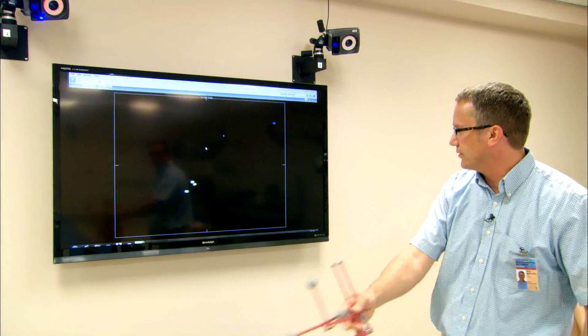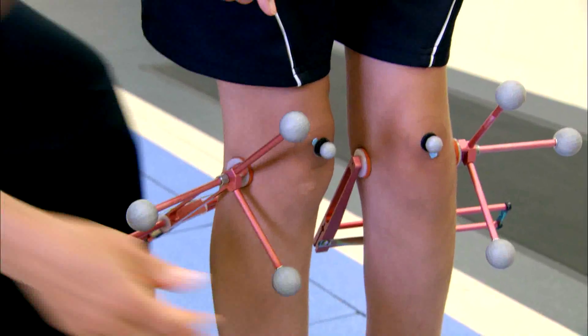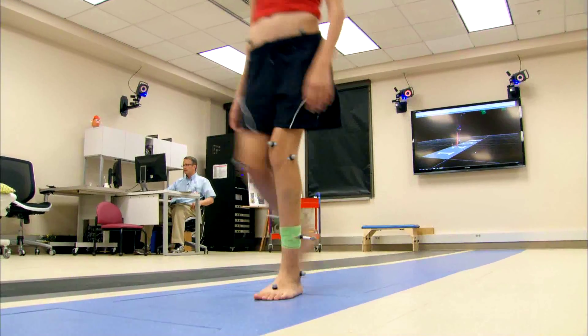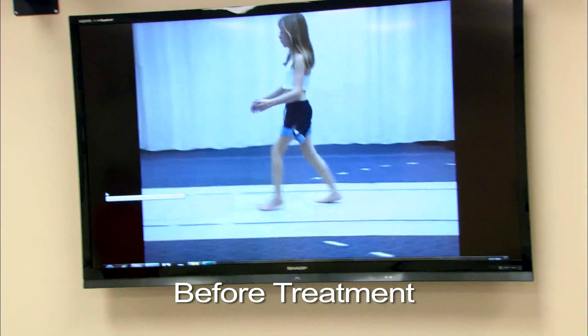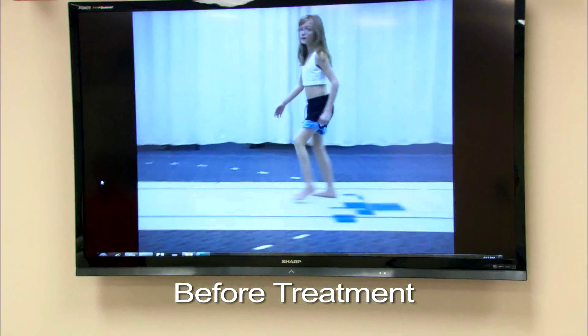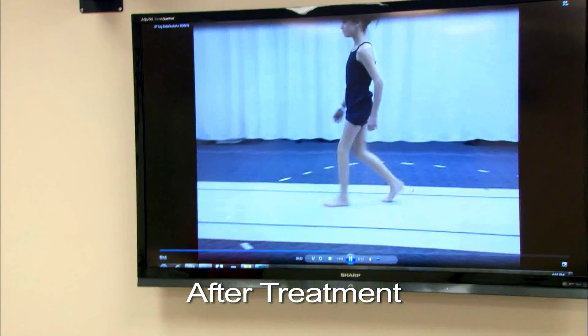Children are referred to the gait lab when they usually have a diagnosis with certain problems with their gait. We look at them, collect the data, and evaluate it to determine what the best treatment would be — that might be a surgical treatment, a brace treatment, physical therapy, or just continuing to observe them. We'll integrate that as we formulate a treatment plan, carry it out, and then the child can return after treatment is accomplished to see if it was effective.